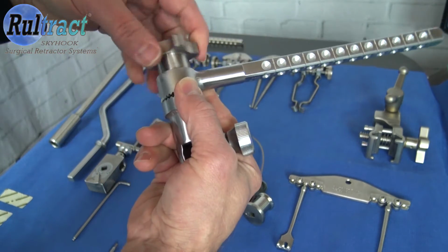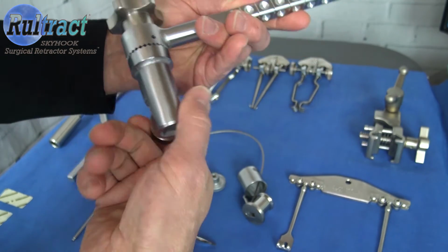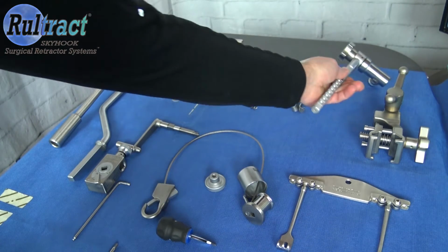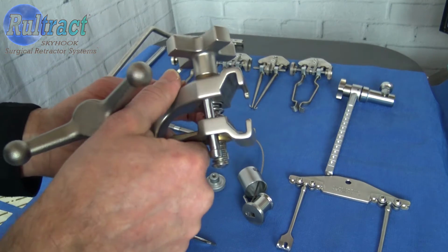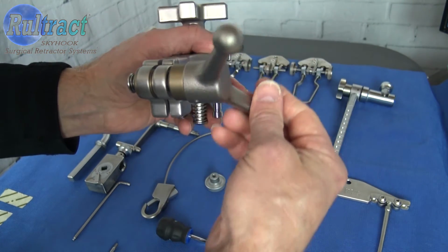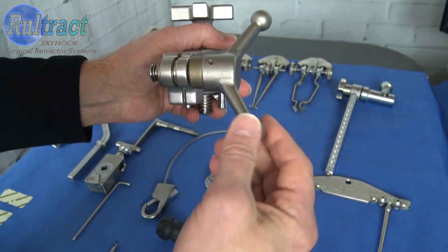You want to make sure that these teeth are separated and move freely. You don't want your jaws to be opened or closed all the way. Have them somewhere right in the middle. With this handle, just make sure that it moves freely and it's somewhere in between open and closed all the way as well.